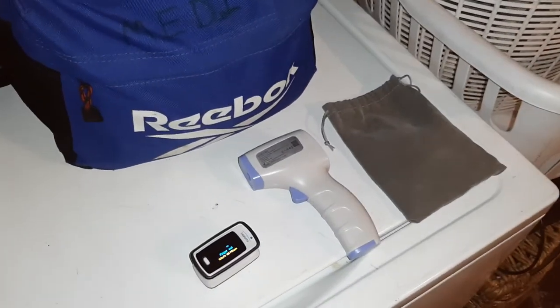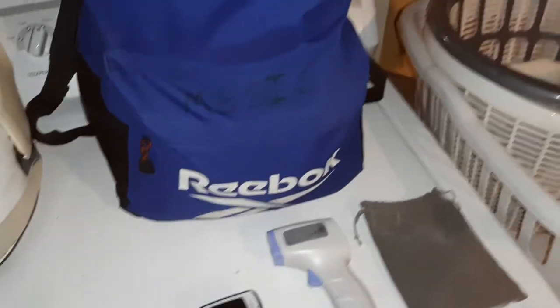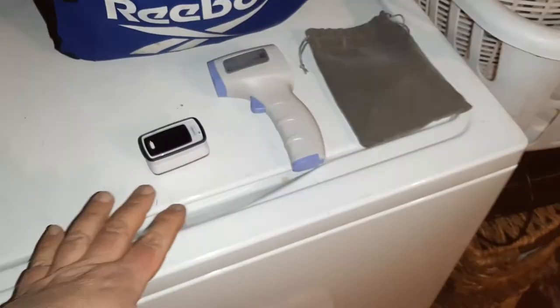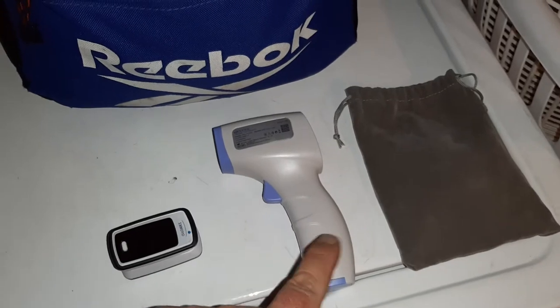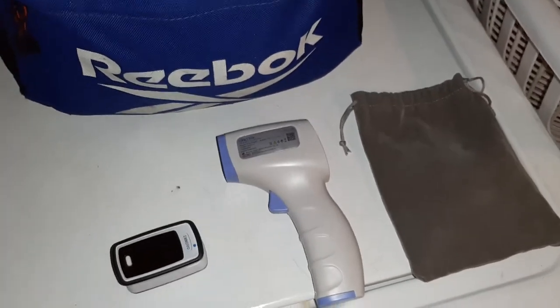Hey everybody, what's up? Just wanted to do a quick video about what's in my medic kit, which is now kind of transformed partially into my COVID compliance officer kit, health safety supervisor kit — you get the idea. Two items that are in there are a pulse oximeter, which basically measures a person's pulse and their oxygen level, and also the infamous forehead thermometer, infrared gun — whatever you want to call it — to measure a person's temperature.